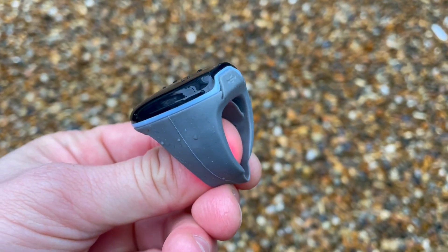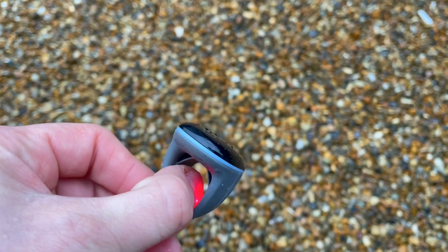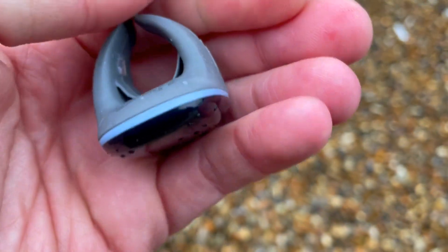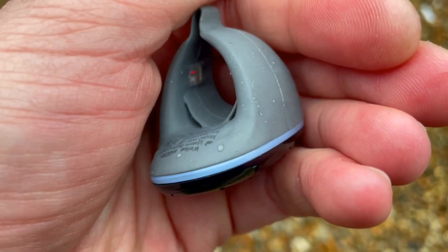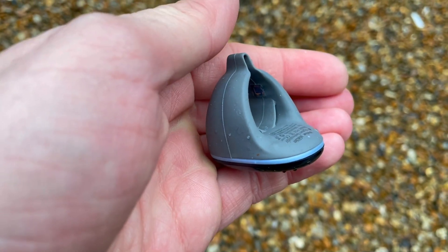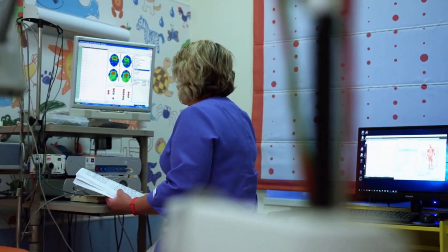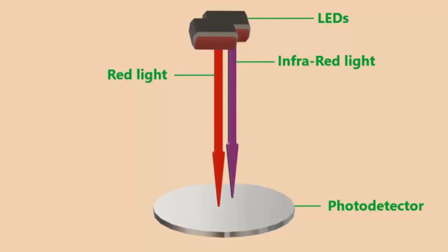The inner ring is made of soft silicone that wraps around your finger for a relatively tight fit, keeping the device in place and stopping it from spinning around. The ring circumference is rubberized and stretches from 50 to 82 millimeters. Looking inside the ring, you'll see the LED emitter and the photodiode on the other side — these indicate that the O2 Ring implements transmissive pulse oximetry technology.